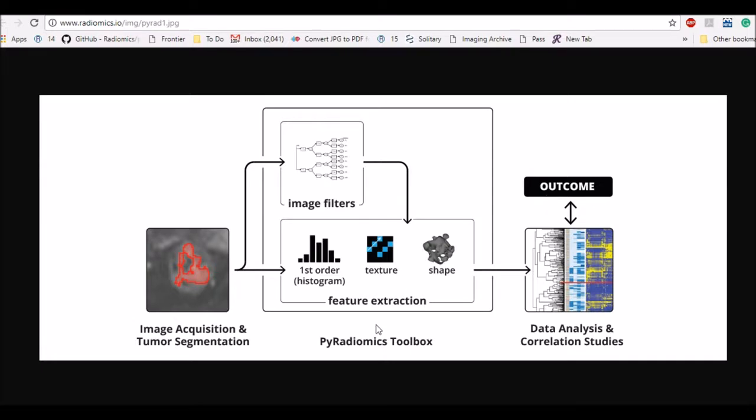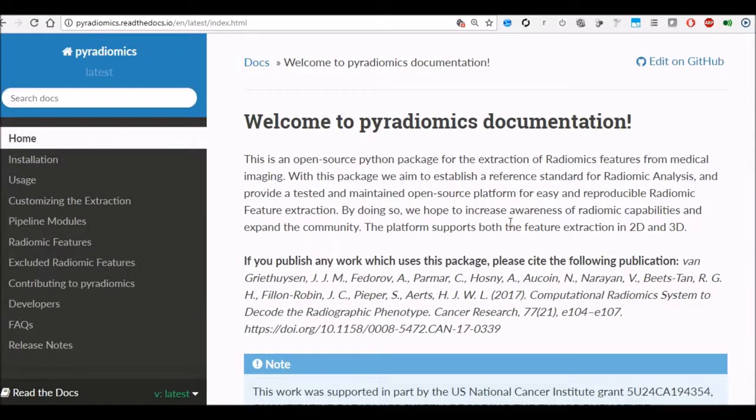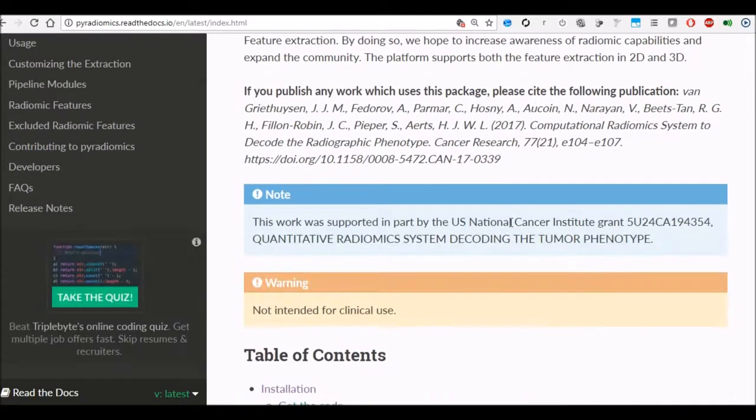PyRadiomics in all offers several built-in image filters and more than 140 feature extraction algorithms which can be used for further data analysis. In today's video I'm going to talk about how to install it.